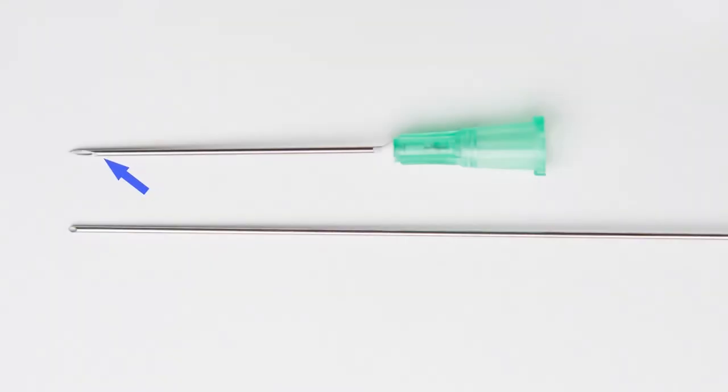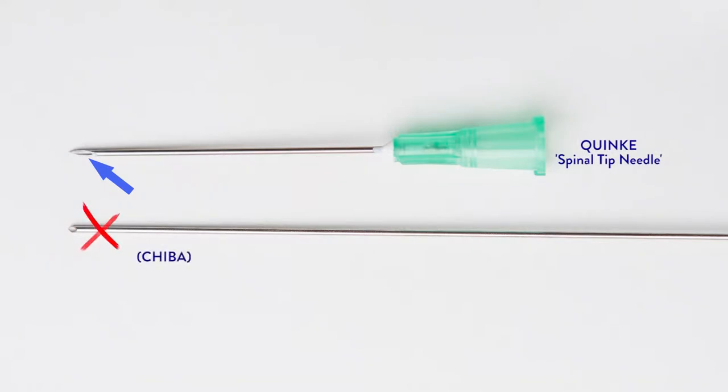Equipment. Long beveled needles, such as Quincke, preferentially collect cells of interest such as epithelial, hematopoietic, and mesenchymal neoplastic cells, and leave behind most of the stromal material that often dilutes a neoplastic component. A separate needle should be used for each pass.